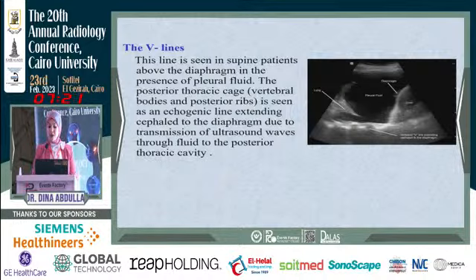The chest wall lesions as rib and sternal fractures can be better detected by chest ultrasound, especially in the acute post-traumatic period, in comparison with chest X-ray. In ultrasound, we can see the muscular and subcutaneous hematomas. Chest ultrasound is important in detection of pleural effusion and hemothorax, even minimal amounts can be detected.